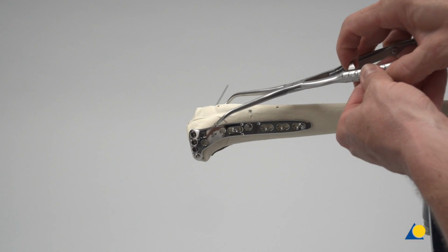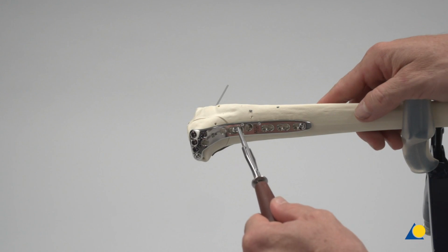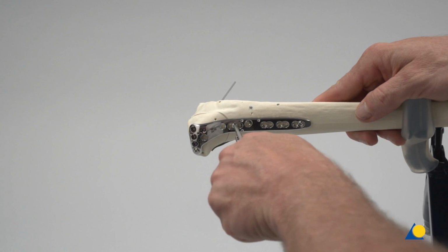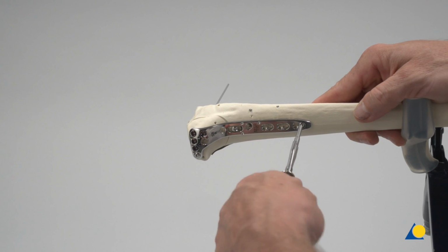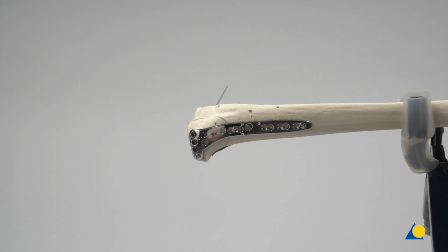The reduction forceps is removed and the two distal cortex screws are retightened in order to ensure that the optimum buttressing effect of the plate is achieved. As the screw insertion at the proximal end of the plate can potentially loosen the screws at the distal end, it is crucial to verify that the distal cortex screws are secure.